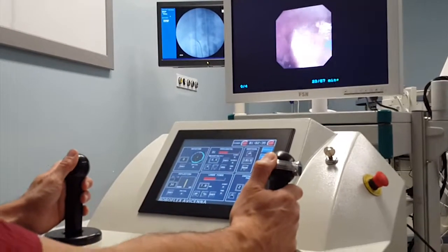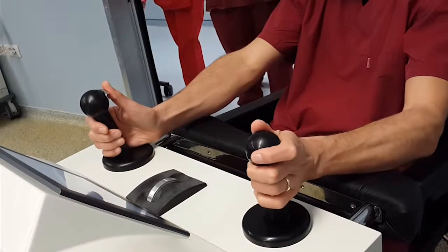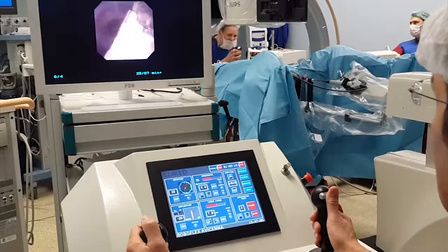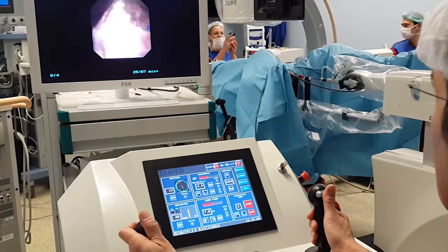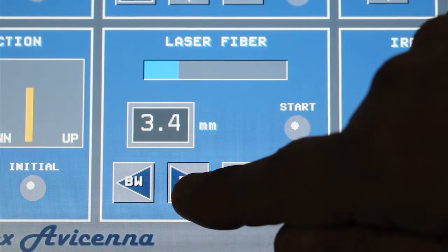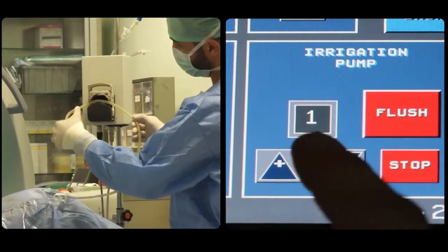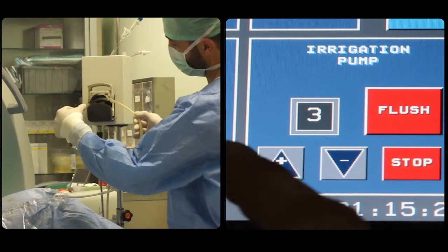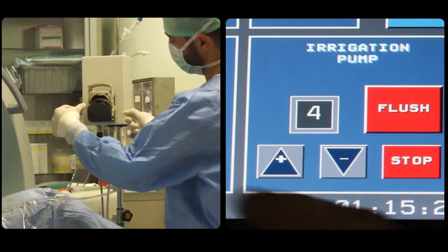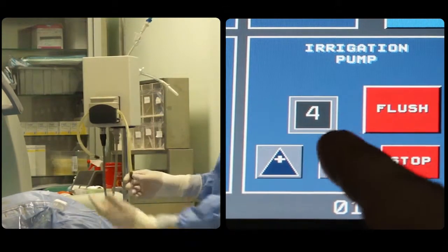Once the stone is visualized endoscopically, intracorporeal laser lithotripsy can be initiated, preferably aimed at dusting the stone through precise rotation and deflection of the scope. The laser fiber can be remotely moved in and out. The integrated water pump can also be adjusted to increase or decrease the flow rate for optimal endoscopic vision. It is also possible to produce low-pressure flushing.